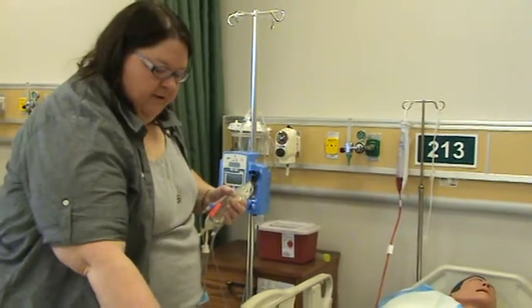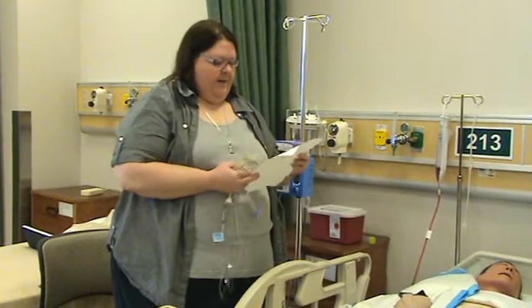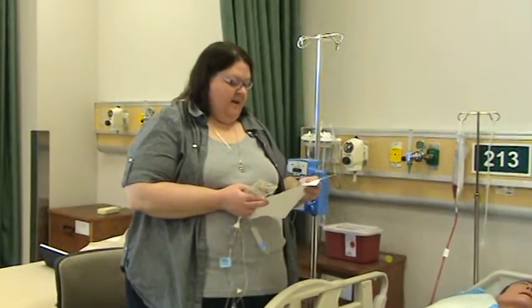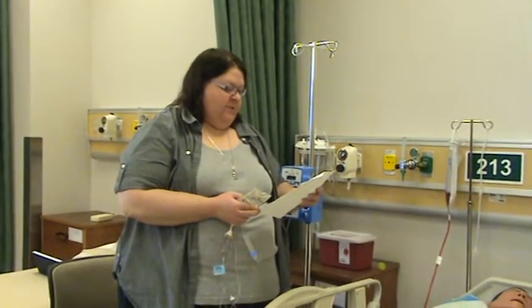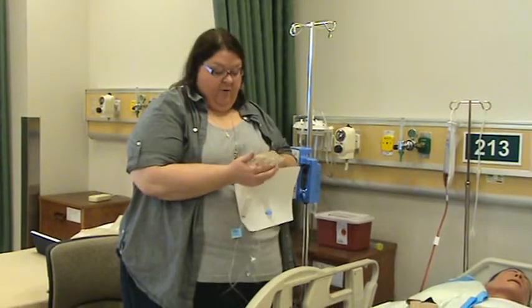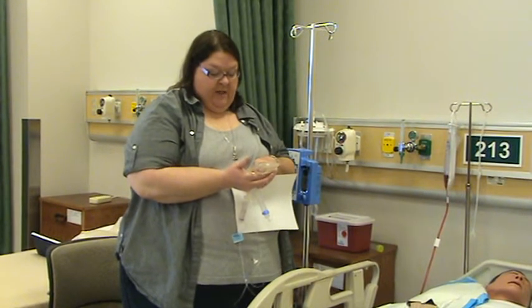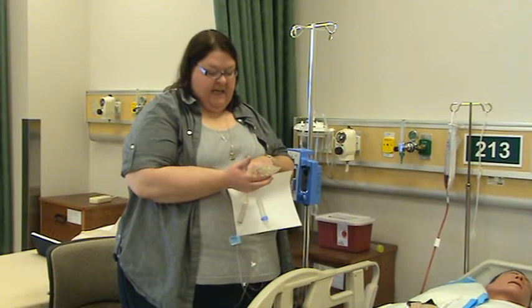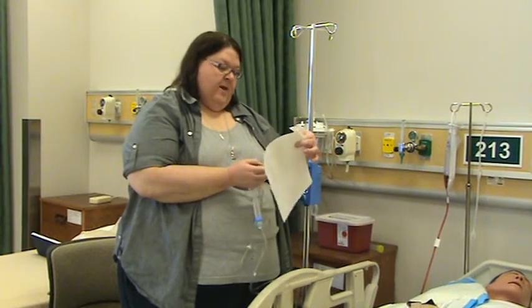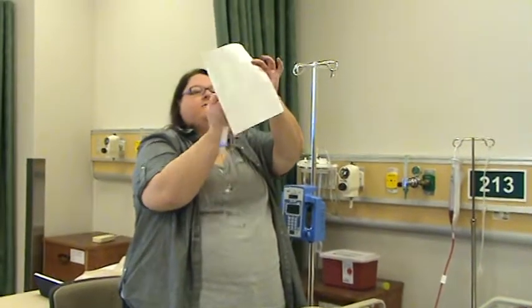Third med check at the bedside: for Winnie the Pooh, bed 211, MRN 1929-569, I need 250 milliliters normal saline with 125 milligrams Diltiazem at 10 mg per hour IV due now. I have, for Winnie the Pooh, 1929-569, Diltiazem 125 mg, mixed 8/5 at 10:05 AM, expires 8/6 at 10:05 AM. It is a 250-milliliter bag of normal saline expiring May 2015, clear, colorless, no floaties, IV due now.